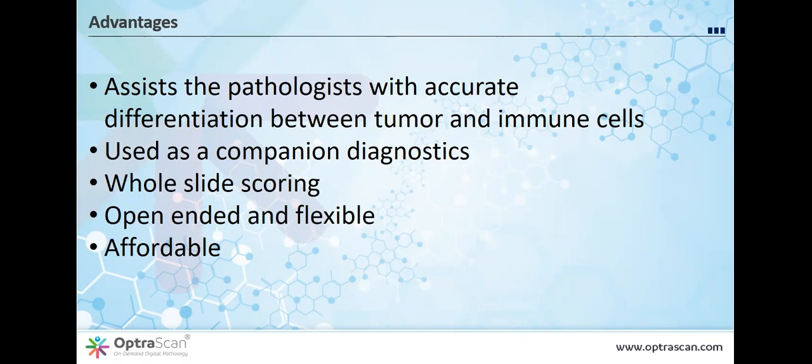test was being calibrated to try to match which patients responded and which ones didn't, the pharma companies, together with their pathology vendor collaborators, were trying to develop an assay to give the best predictability. And it turned out that you had to incorporate both tumor cells and immune cells in some way in that assay, and different companies did it in different ways. Unfortunately, not everybody did it one way.